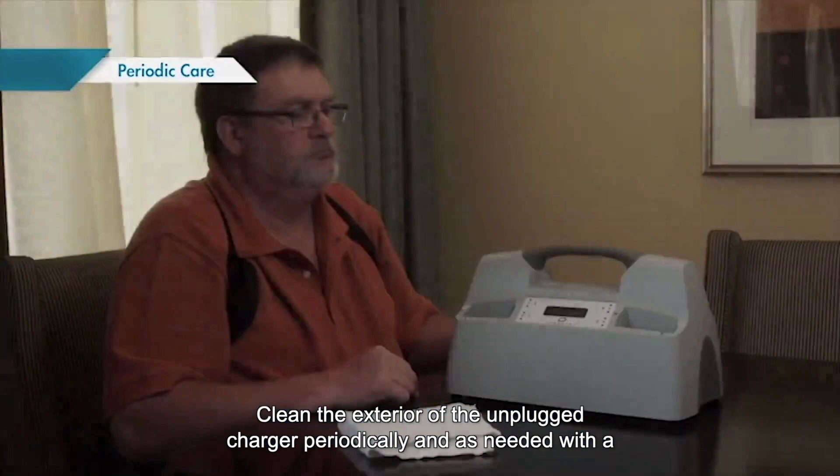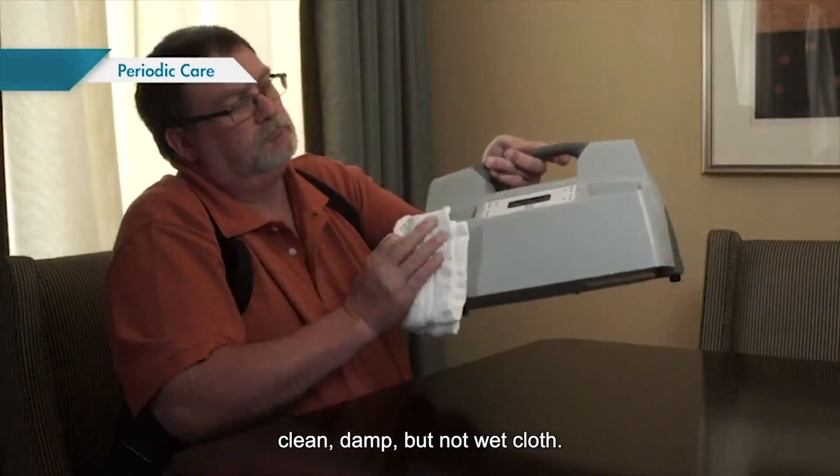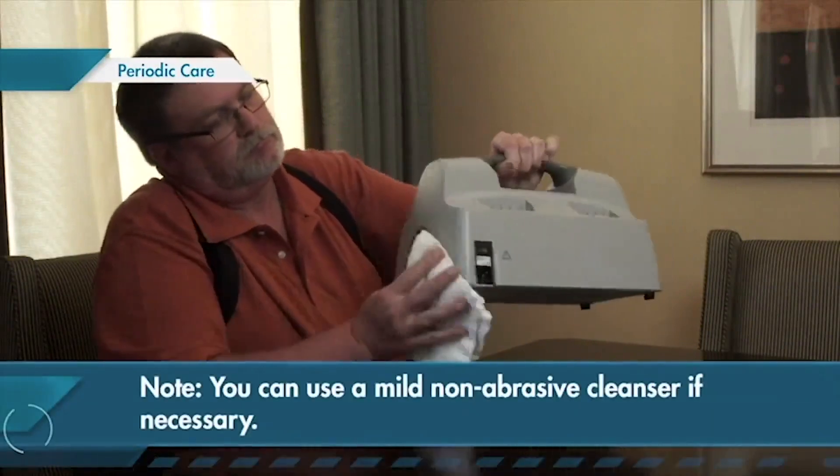Clean the exterior of the unplugged charger periodically and as needed with a clean, damp, but not wet cloth. You can use a mild, non-abrasive cleanser if necessary.